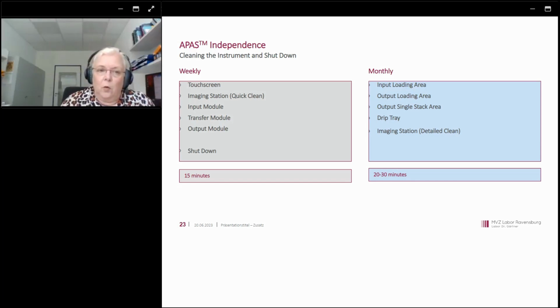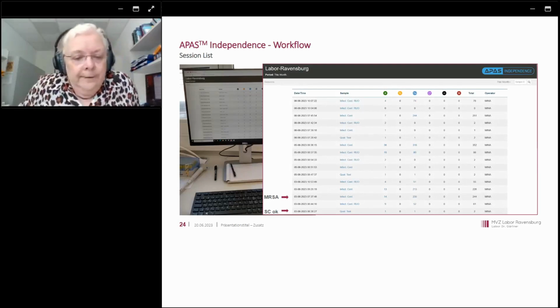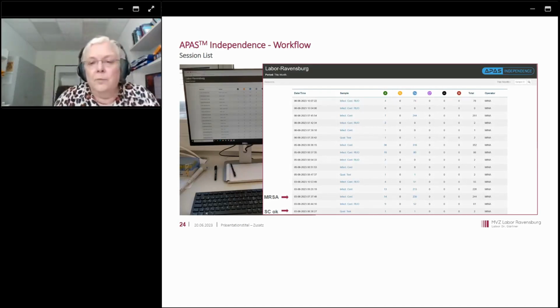So how is the workflow? When you start a session in the morning, you will come to a so-called session list. In this session list, you have displayed all the sessions run, as you want: all of a day, or all of a week, or all of a month, or the last month.